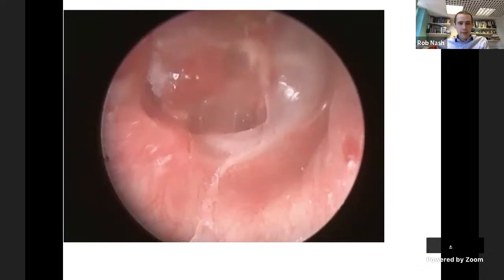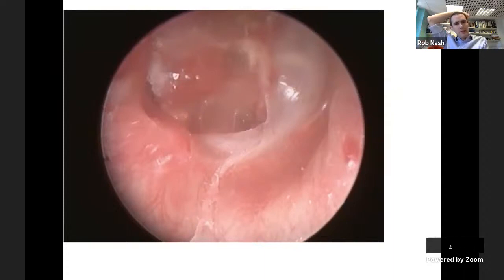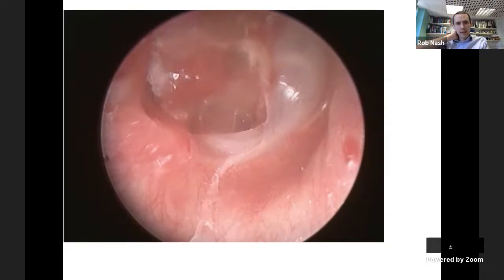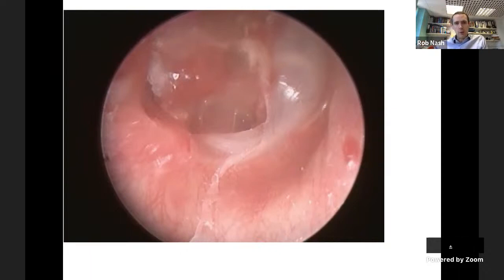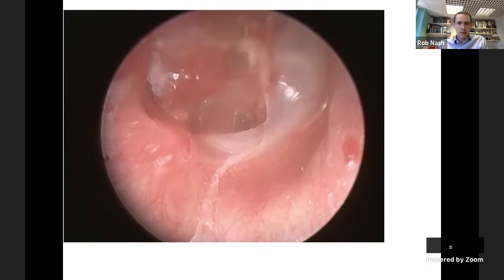This case is also typical for wanting to arrange imaging. The membrane has a perforation - the anterior part is intact but the posterior part is absent - and within the middle ear there's inflammatory granulation tissue with a little keratin around the edge. You'd be very concerned about cholesteatoma, and you'd want to see how much ossicular erosion there has been. The posterior annulus looks non-circular, as if a chunk has been taken out - further raising your suspicion.